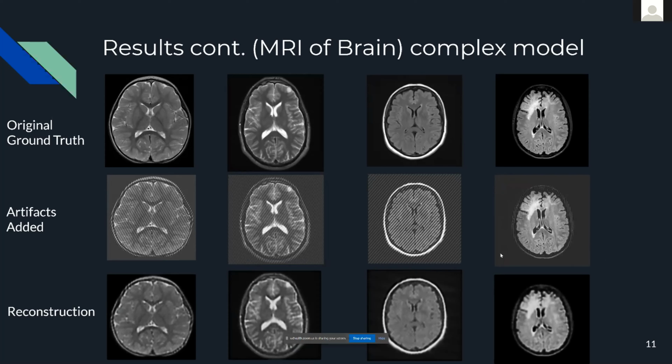The reconstructed images look a lot sharper, although not as sharp as the original image, and you can see a lot more details. In addition, there are no more streakings compared to the simple model. In the simple model, you can still see very faint outlines of streakings, but in this one, they're a lot better, and the upsampling did in fact restore some of the loss of resolution.